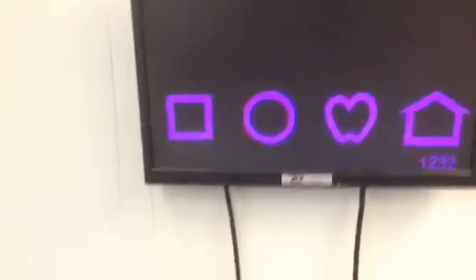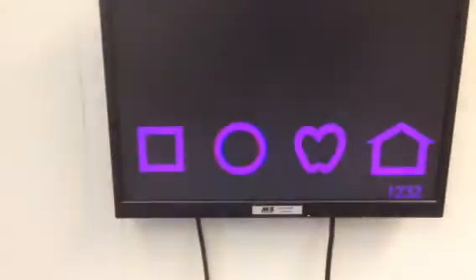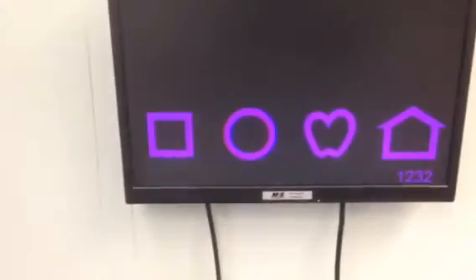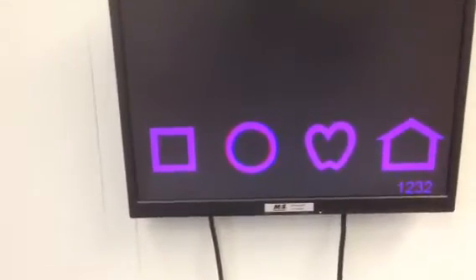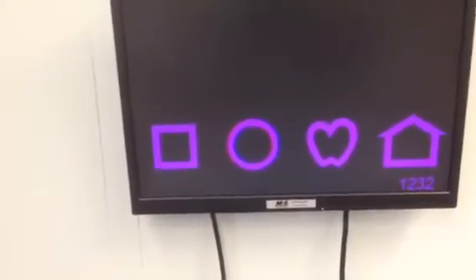So if you want to do contrast testing on this you're going to need to go to the study tab on the tablet. And the study tab should change us over to give us a different menu. It's just like a labeled remote. And you'll see there's letter contrast, sign contrast, and there's also sign protocol with some instructions. So I'm going to go first to letter contrast. That's the easy one. And we're going to click on that.